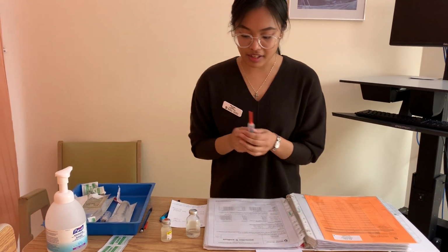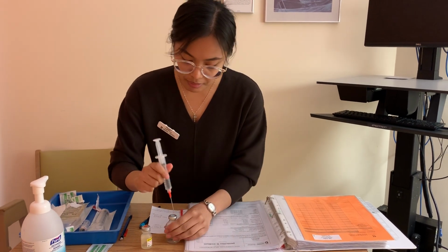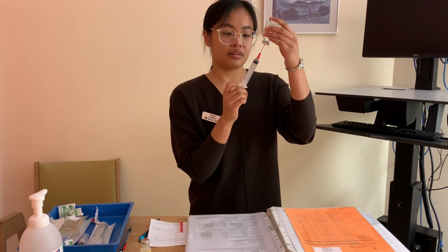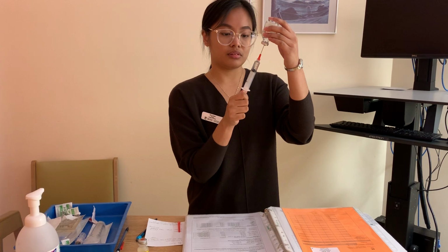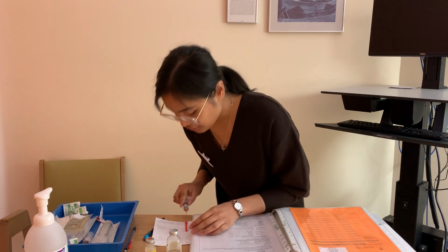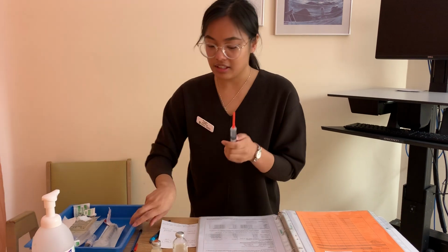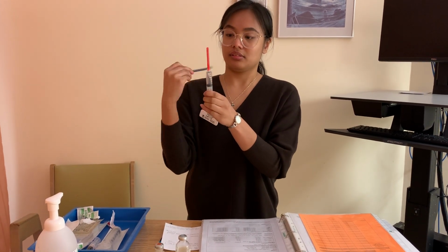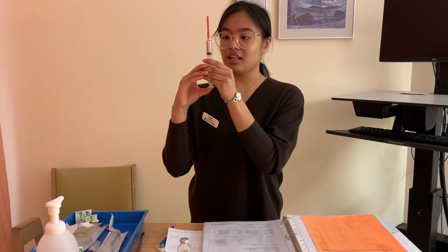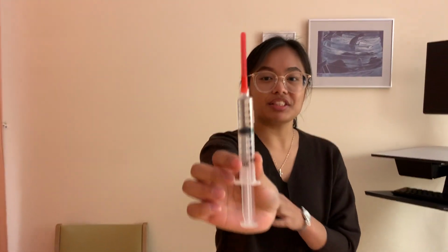Okay, now I'm going to get my 5 mLs. So I'm going to get 5 mLs of air again, and cap, and I'm going to put the pressure in and then get my medication. I'm going to grab a little bit more excess so I can recalibrate later on. I'm going to recap. Okay, I'm going to get rid of the air bubbles. Make sure there's no more air bubbles. I'm going to recalibrate. Again, I put this in the sink. Okay, so that's my 5 mLs from the syringe that I calculated.